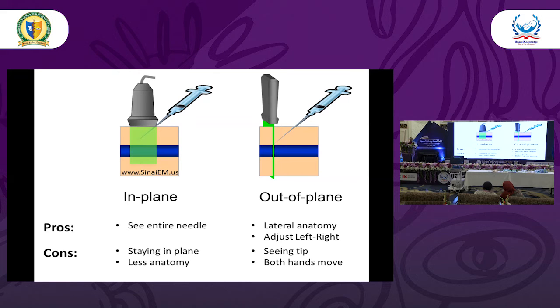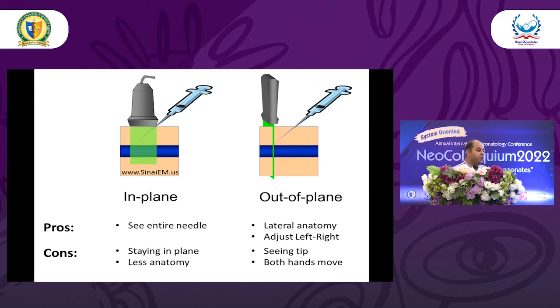So it's easy to say. You'll just place the probe on the vessel, but you should know the anatomy. You should know the machine handling, probe handling. You should know how to make yourself comfortable with the machine and then put the needle. After that, you'll be easily able to see where the needle is going. But if you're not able to manage yourself on the machine or the probe, then the needle will not be visible at all.